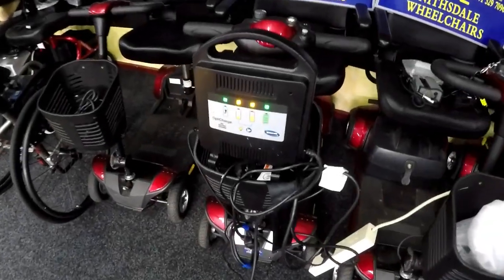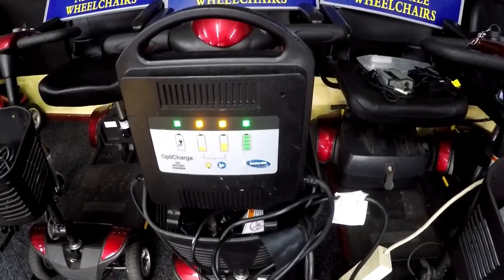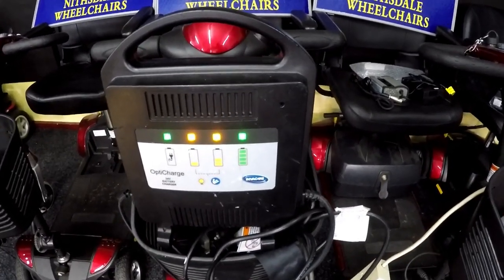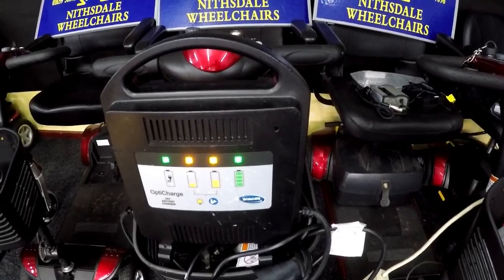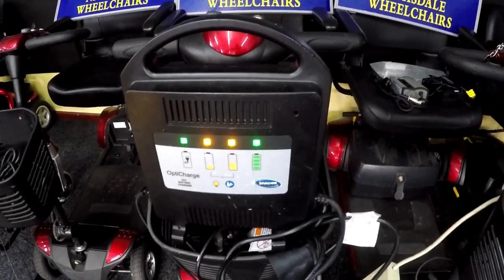Right, that's me come back the following morning, and for a change the two yellow lights are not flashing away. We solved the problem with the right connector for the scooter and the charger. So now it's fully charged, what I'll do is switch it off, switch the charger off and leave it for half an hour before I test the batteries, and we'll see how we go from there.